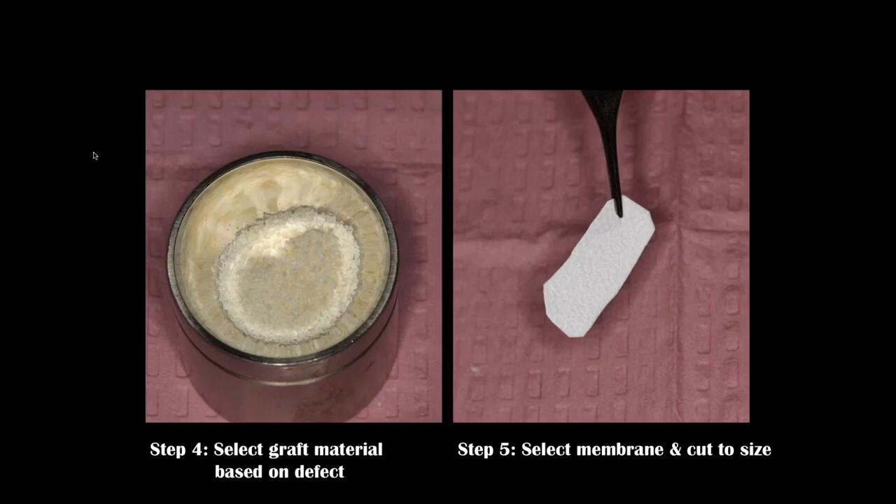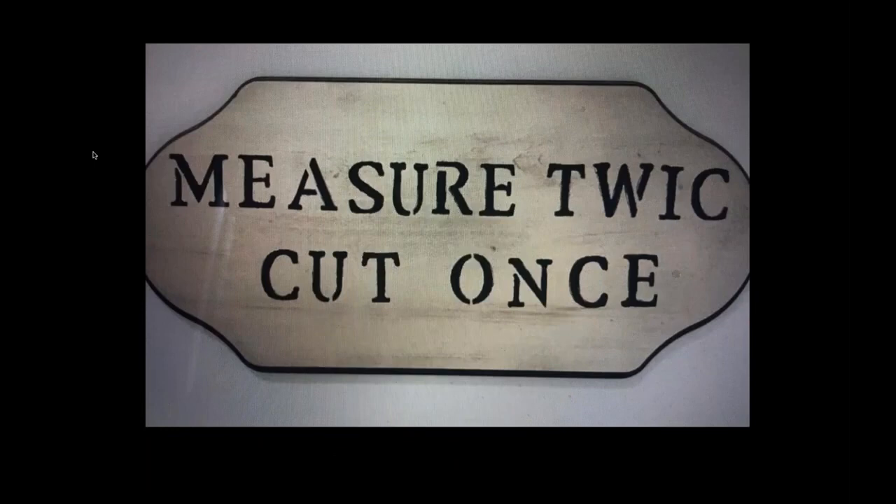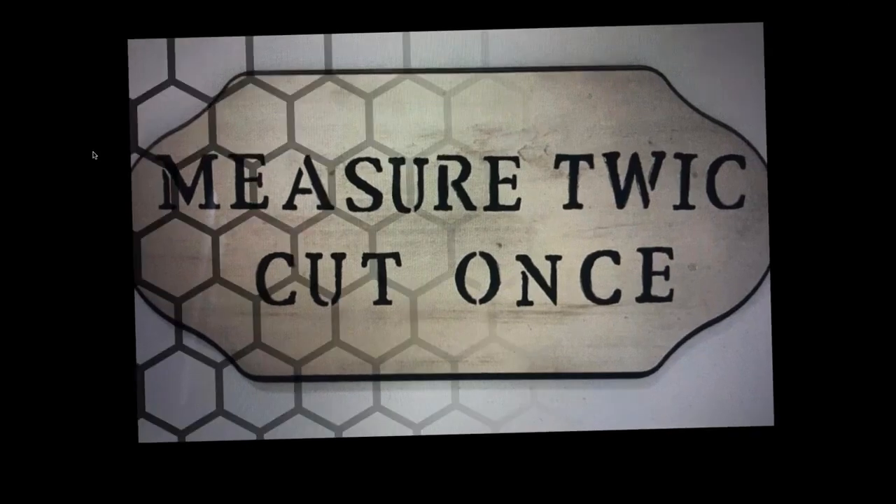I'm wetting the allograft material with either sterile water or sterile saline. Here I'm using an Epi-Guide material, which is a resorbable membrane cut to size. We want to measure twice, cut once — my dad was a carpenter so I love that — to eliminate mistakes. You can grow a facial plate of bone 100% of the time using this technique.